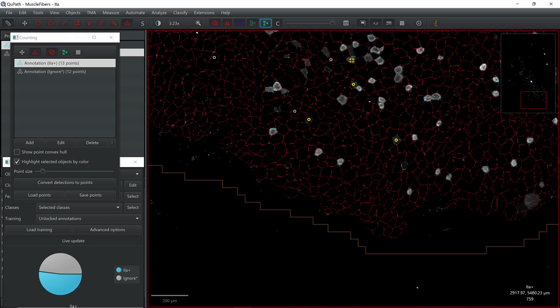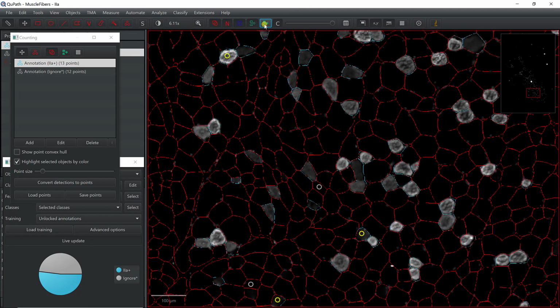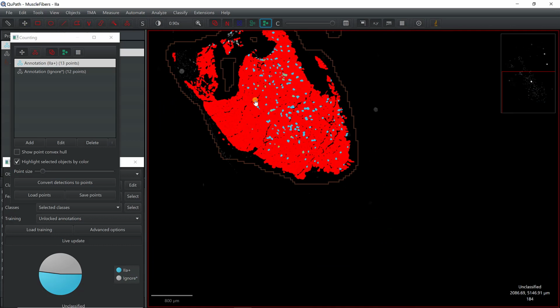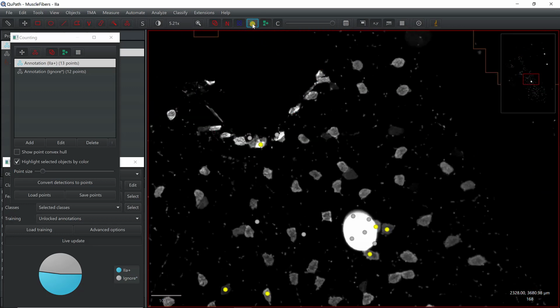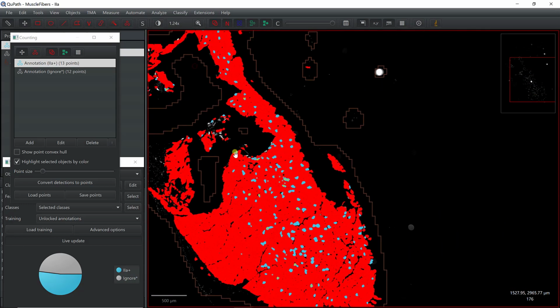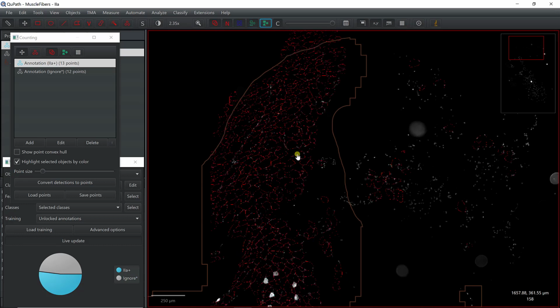The faint ones are considered positive, and that seems correct. It doesn't seem that there are negative examples considered as positive. Now let's just go back to regions that were more problematic in here. And that's fine. So here it seems that there's nothing. Is it because we have nothing? Yes, we have nothing. All right. So now I'm happy with that.